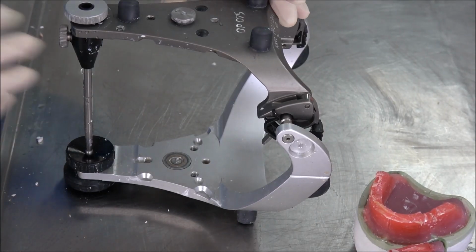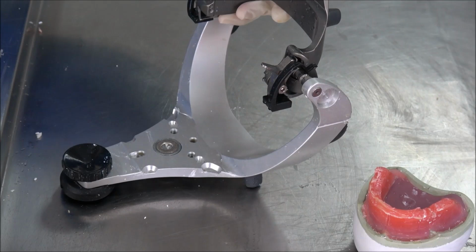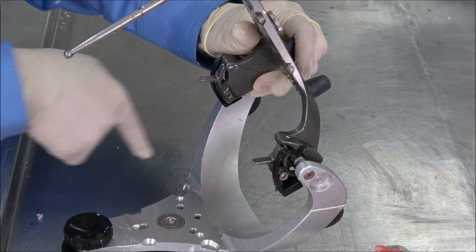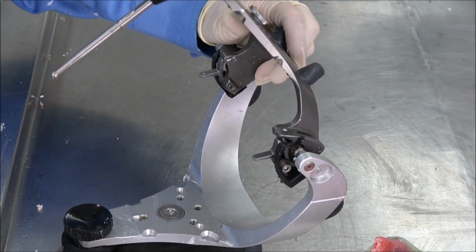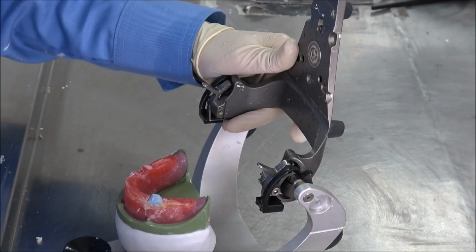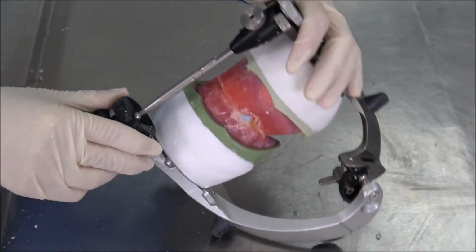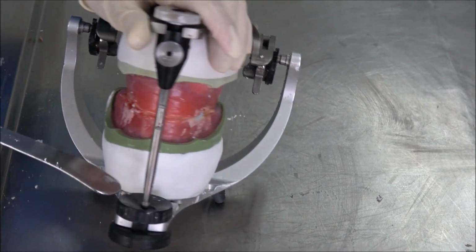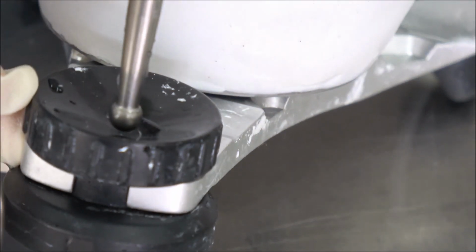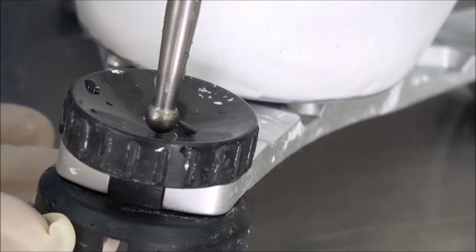Okay, before you fix your mounting, your model pad, make sure your articulator is clean, because when you're mounting, there is a lot of POP sticky here. Make sure you clean it up before you fix back your models. Okay, after you clean, we just fix back, upper and lower, and we check back our bite. Make sure when you fix back, there is no high bite, there is no gap here. Make sure the incisor rod sits properly on our incisal table.